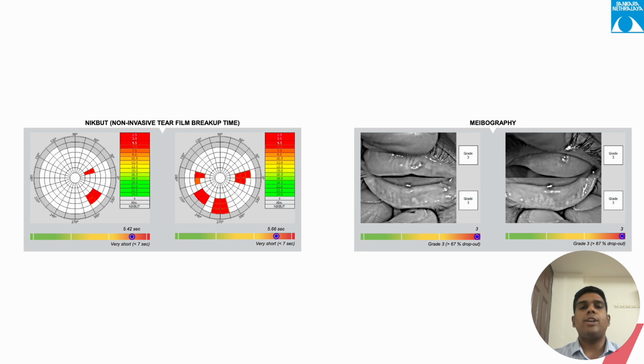So here is the keratograph of a meibomitis patient with a grade 3 meibomian gland loss. These patients usually don't respond well to warm compress or lipid therapy. Thus, this meibography helps us to understand the disease as well as choose appropriate therapy for the patients.